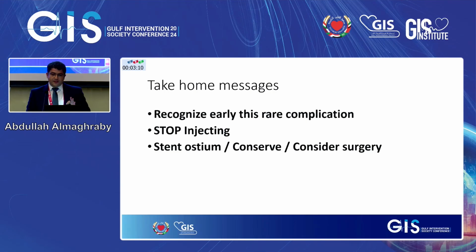Stop injecting. The first thing to do is stop injecting in the coronary, and then either, according to the classification, stent the ostium, conserve, or consider surgery.